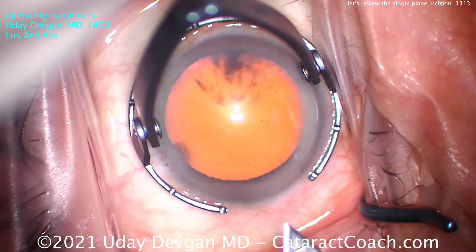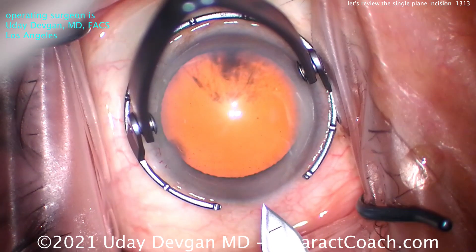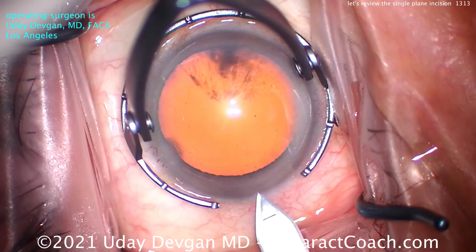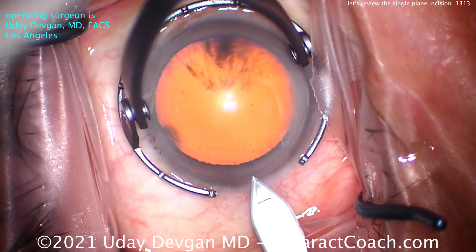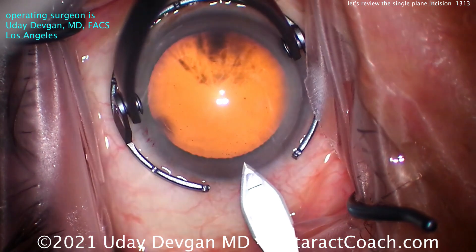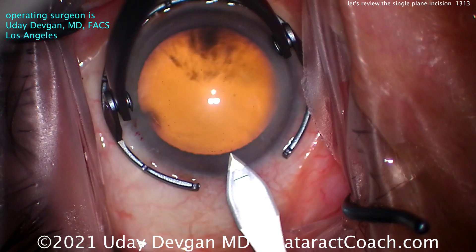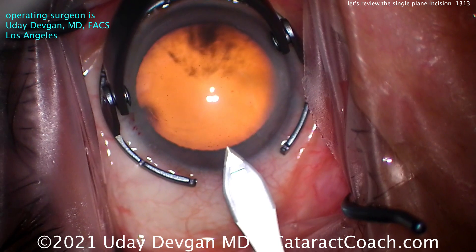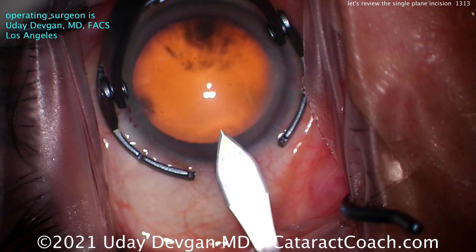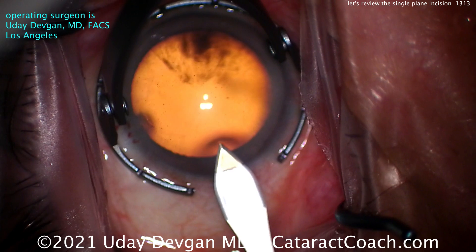Now let me show you again in even slower motion. Fixation — when to hold the eye. Here comes the keratome, starting right there where the limbal vessels exit the cornea. No conjunctiva, still cornea, but hitting those limbal vessels. Start to advance it, and the key is changing that angle. You can barely slip a piece of paper between the blade and the conjunctiva. We advance it, and now that line on the blade hits the epithelium — look what happens to the cornea.